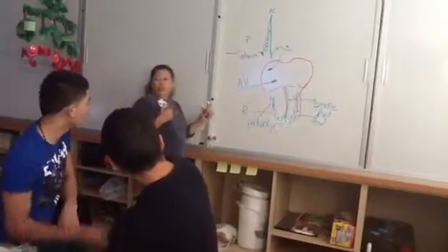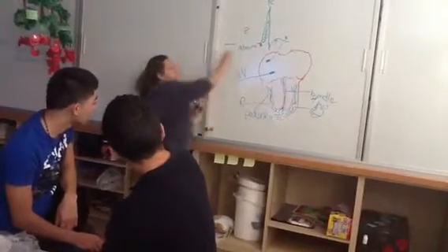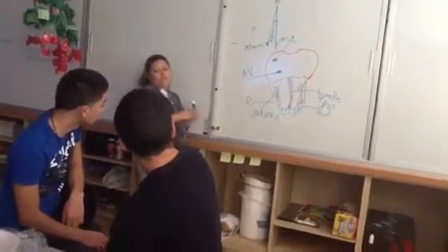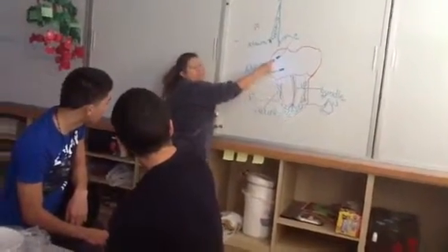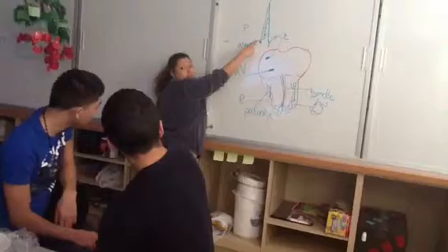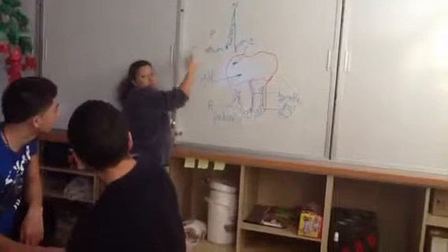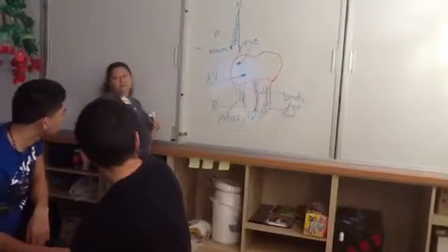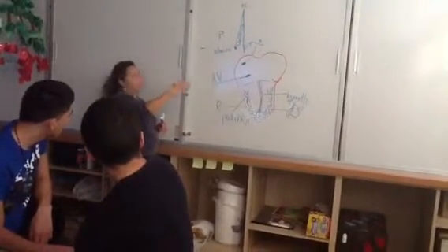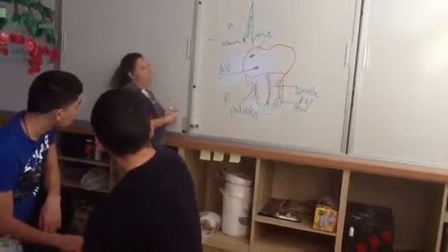I'm going to show you EKGs where this is totally gone. It'll pump, then start there, then pump, and then it'll skip again. That's not normal, but that's if it doesn't start here. If it starts here, you're going to get a normal hump, and the hump starts right there. So it's either going to be in here somewhere, mixed up, or you're not going to see it at all, and it'll totally drop it. That's scary, because that's a 3rd-degree block. That person's going to code on you. They're going to crash. So if you see that gone, that's it, okay?